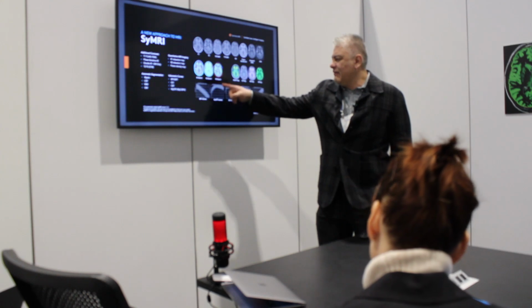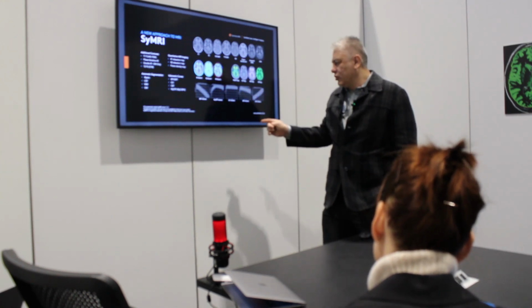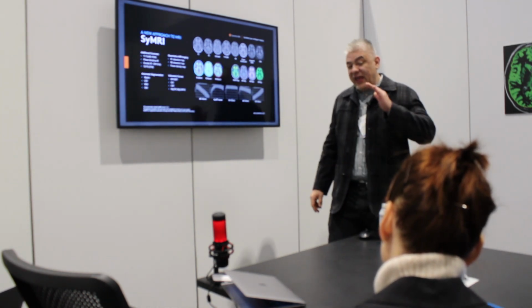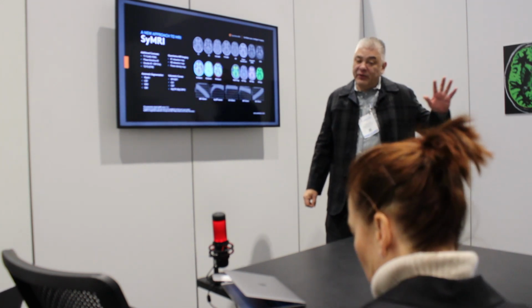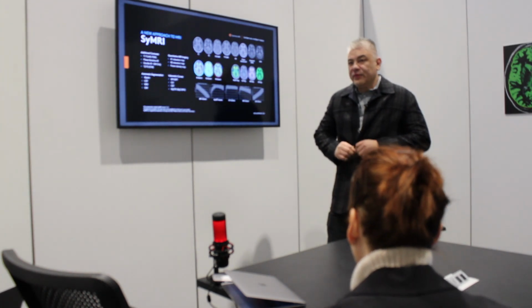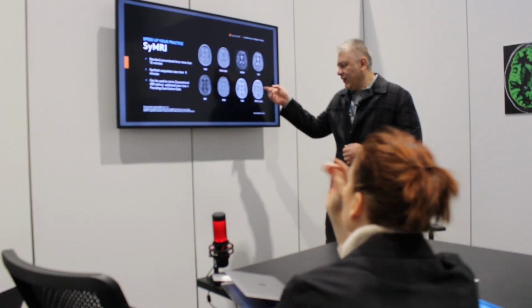And you can see immediately in the studies that we're going to see where it goes. So you get maps, you get curves, you get a report with actual numbers that are standardized by age. So it's all very automated, very smooth. You can do as little or as much as you want, and we'll get into that next. So that's all the different contrasts.